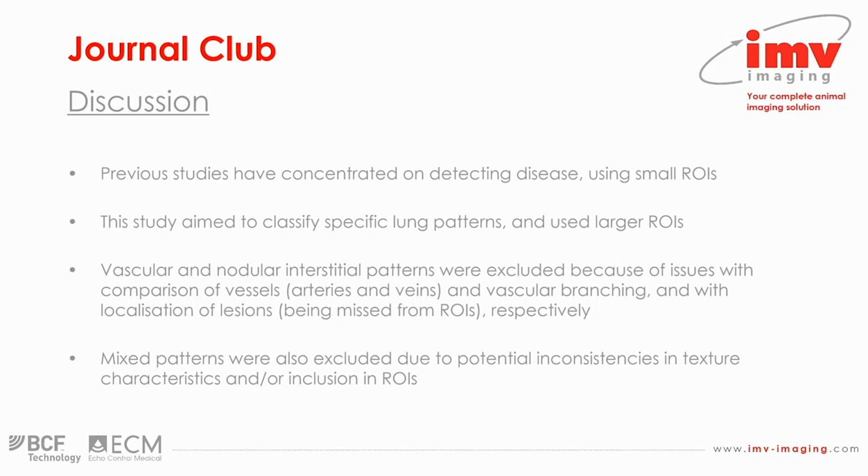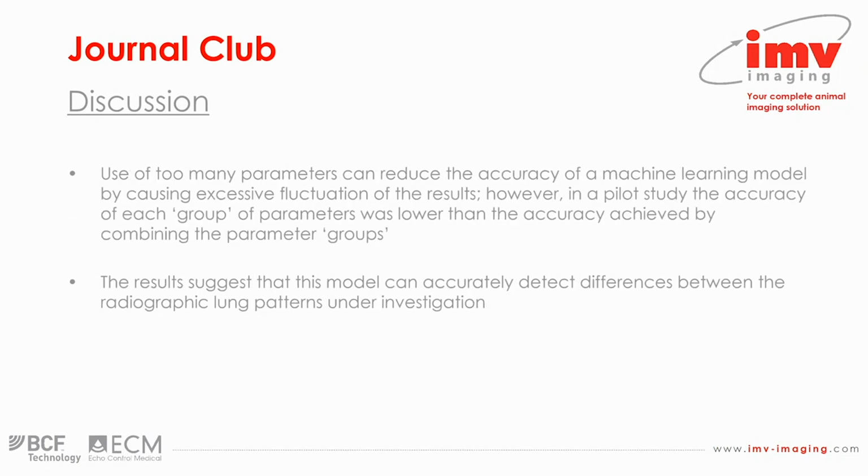As I mentioned earlier, also the mixed patterns were excluded. The rationale for that being that it would be potentially difficult to decide which was the most important lung pattern, the most significant lung pattern, and also, again, for the textural analysis, it would be difficult for the statistical analyses to give reliable textural pattern data where you had different patterns overlaid one over the other within a given ROI.